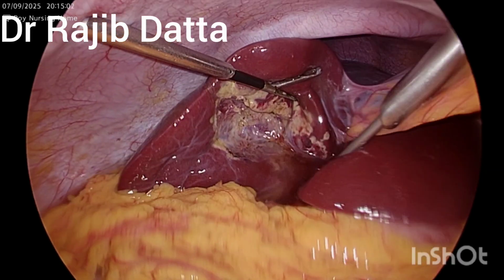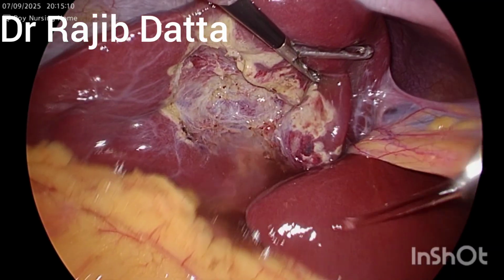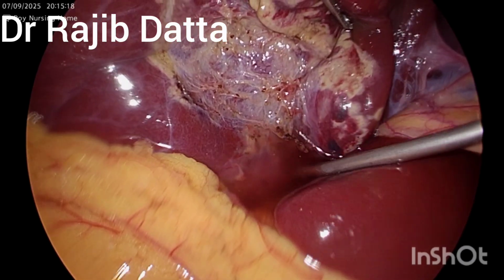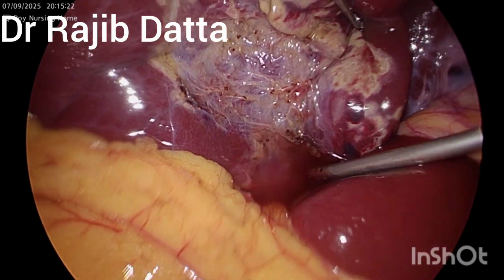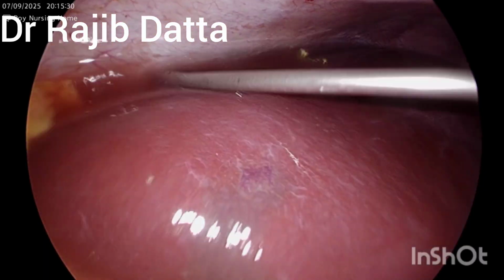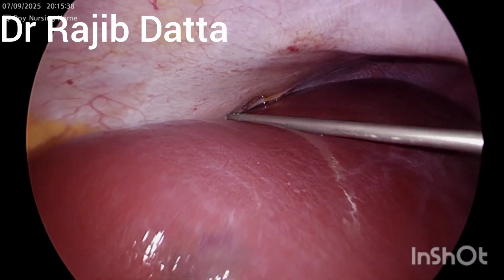So thorough irrigation is the main key, and you can well appreciate the returning fluid is also clear. There is no bleeding at all, and I am just trying to see the clip positions and whether any small oozing from the liver bed is present or not.